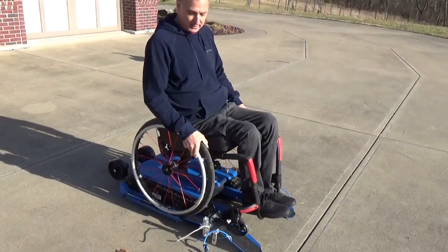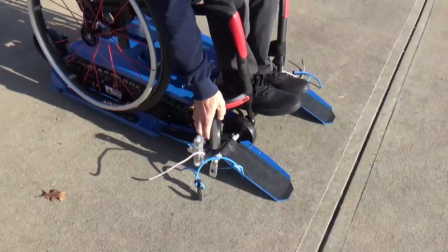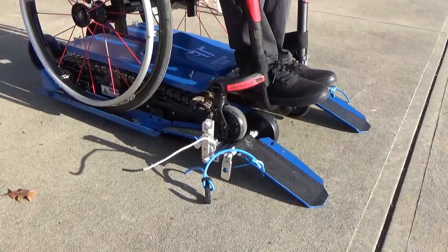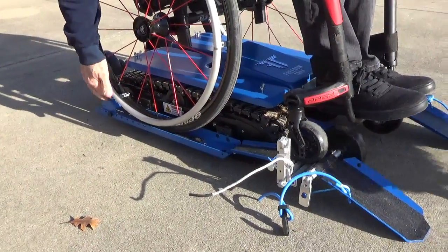And once I get into it, my front casters are still pointing to the rear. So you see here, I'll straighten out the caster. And now that I'm into it, the chair fits perfectly in it. I've got the backstop here up against the back.